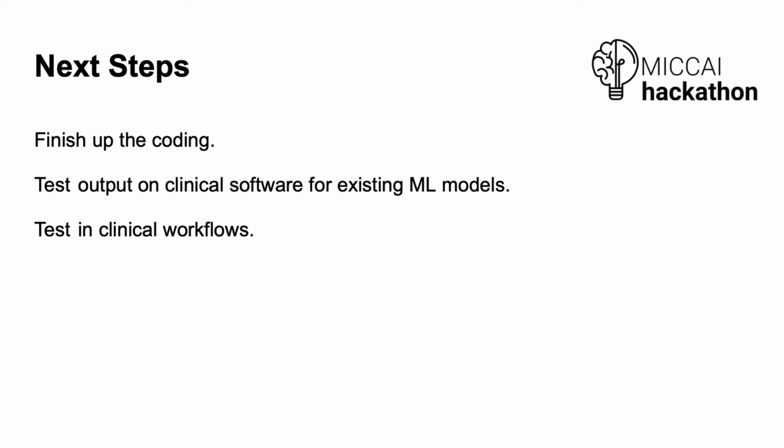One of the nice things about SR, though the clinical systems that I work with don't do this yet, is that if you have the original ML result, you can create a new structured report object that points back to the original, where you accept or reject the findings of the model. And so you can build basically a tree of these things, or a DAG of these things. None of the clinical systems I know support that, but I think we're going to need something like that in the near future, because as we want to scale up the number of models coming in, we want to standardize the format things are saved in, and then we want to build usable workflows around that with the clinicians. And so that's it.